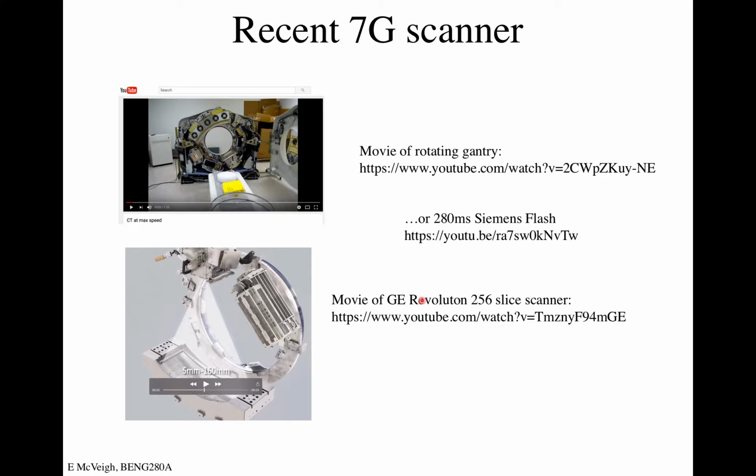So I've put here for you a couple of video links. We just looked at this one, but you can look at this, which is always fun. Engineers eventually in some hospital take the covers off a scanner and just run it as fast as they can and videotape it so you can see the guts of the scanner moving. And so that's what this is here. It's pretty entertaining.